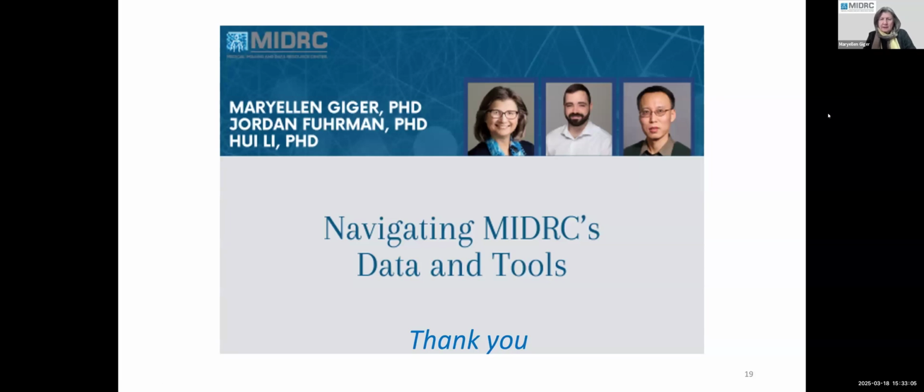Oh wait, there's another one. They keep popping up. Do you plan to publish these tools as Shiny apps or on Python Anywhere? Well, go ahead, either one of you. They are Python in the GitHub. Yeah, you can download these through the GitHub repository. They're not published currently on any other reference, but I think that may be in the future, but we'll see.